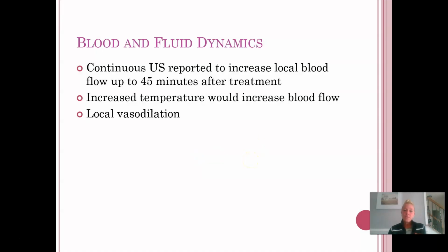As far as blood and fluid dynamics go, a continuous ultrasound, which again is going to heat the area, will increase local blood flow for up to 45 minutes after treatment. So that increased temperature is going to increase blood flow and cause local vasodilation just in the area.